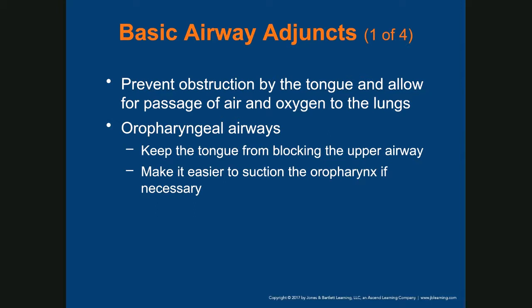Choose the most appropriate suction catheter: rigid for a large amount of secretion, flexible for minimal secretion or secretions coming from the nose. Suction pressure should be at least 300 millimeters of mercury. Measure your suction catheter for depth. Once you insert it inside the airway passage, you will suction coming out. You don't suction going in.